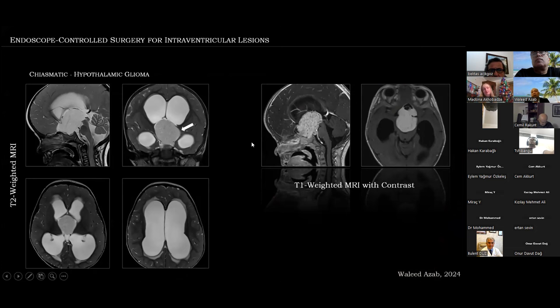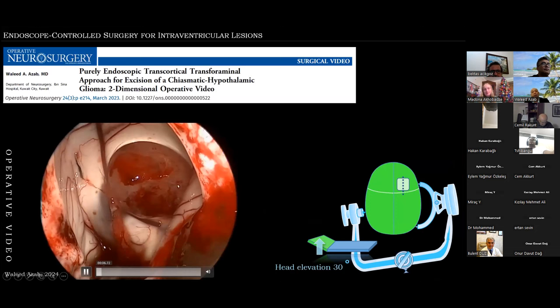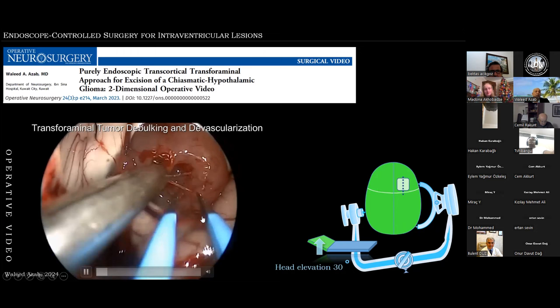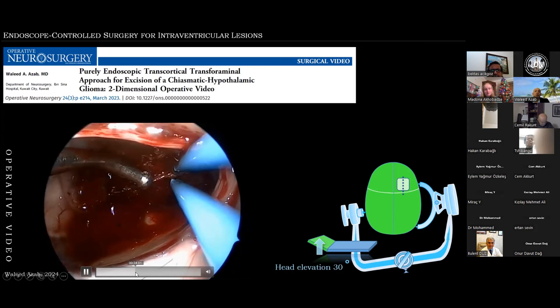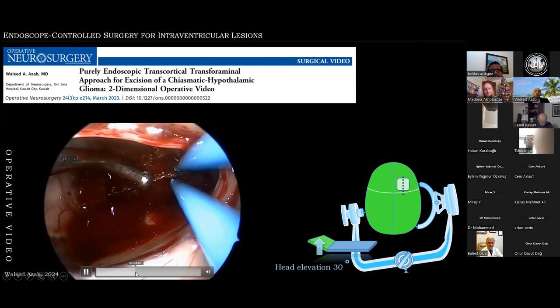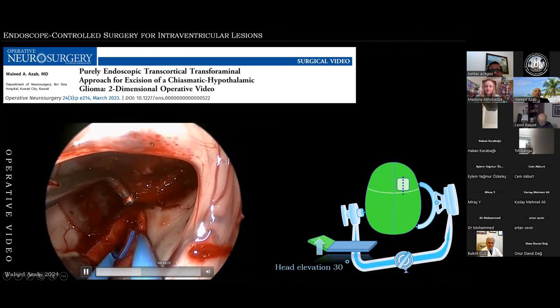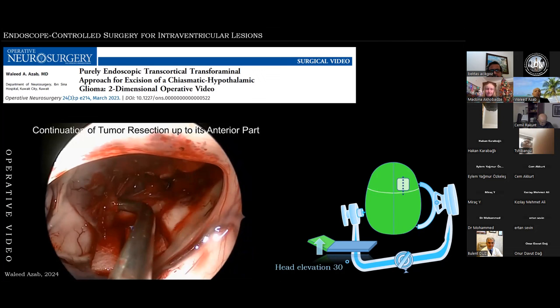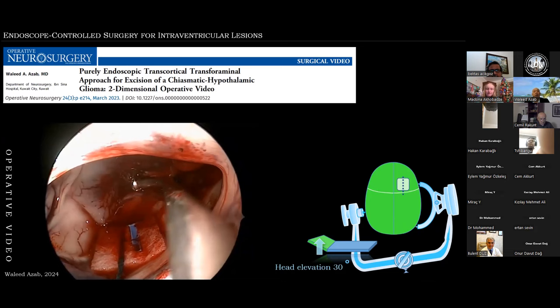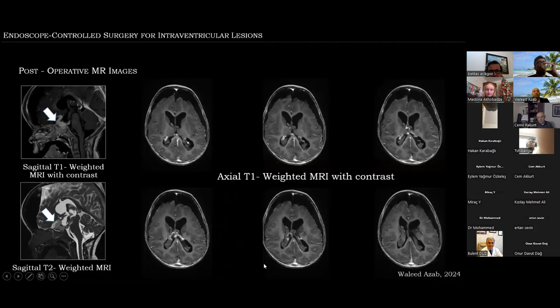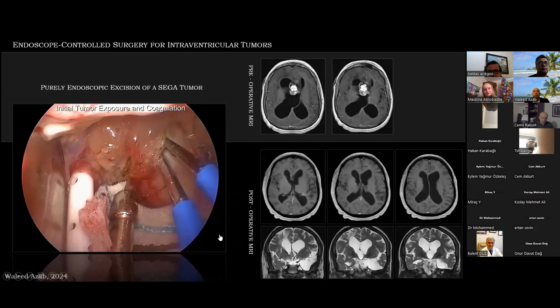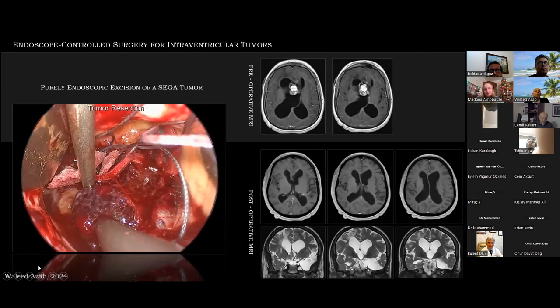The next case: endoscope-controlled surgery for an intraventricular chiasmatic-hypothalamic glioma in a very young child. Here is an initial view of the tumor seen across the foramen of Monro. The same microsurgical principles are applied: hemostasis, bimanual dissection, then resection of the tumor stopping short of its hypothalamic attachment, and anteriorly to avoid visual impairment. The whole anatomy of the third ventricle is seen with the rigid 4mm scope. Post-operative MRIs show complete resection of all tumor except the deliberately left anterior component to save vision.